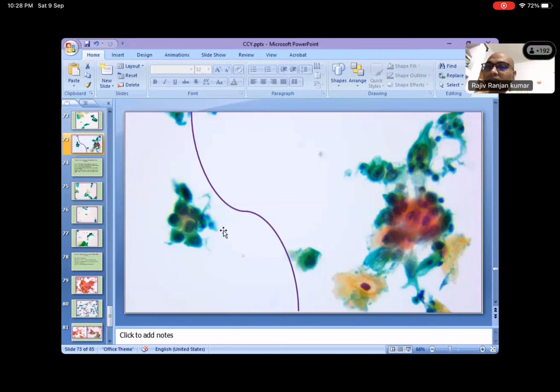Similar parabasal cells. But what do you think about this orangeophilic cell? There is some vacuole around it. There is some cytoplasmic orangeophilia and some partial perinuclear cavitation, perinuclear vacuolation. Yes. So what do you think it will qualify for?